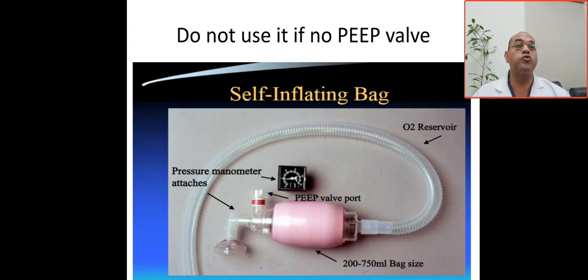If we see here, don't use it if no PEEP valve. Where is the PEEP valve? Here, this is the PEEP valve. This is the red area. This is the PEEP valve.